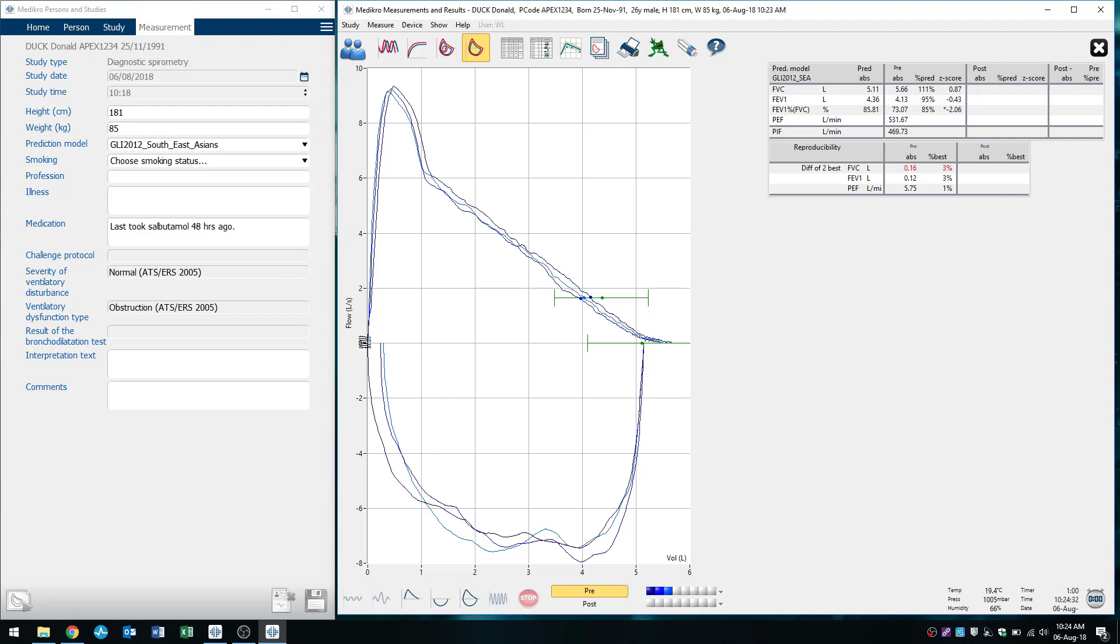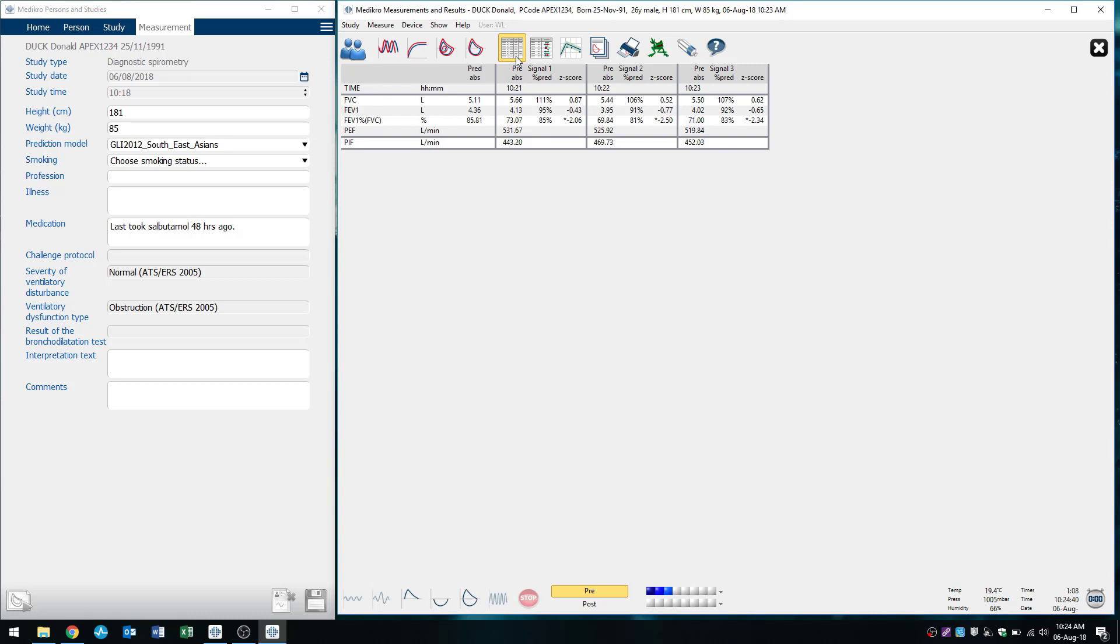So you can see here that my loops are more or less overlapped on top of each other, which is great. And we're just going to quickly review our results here. So if we click on this button here that says show measurement results, it will show our results.